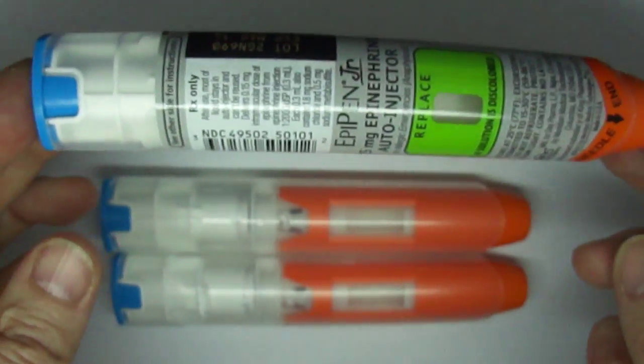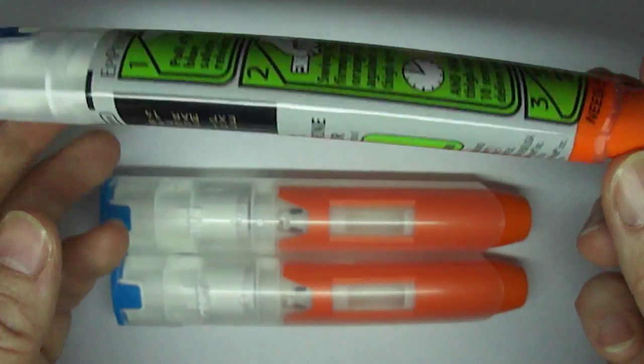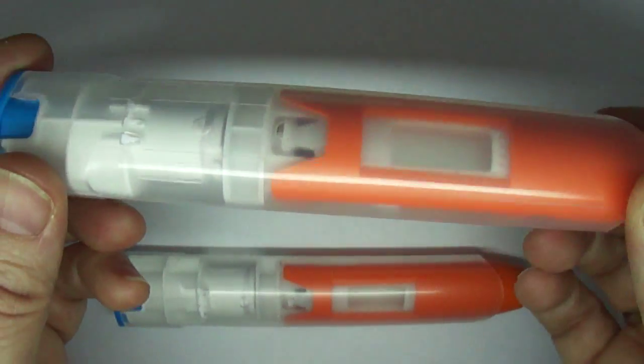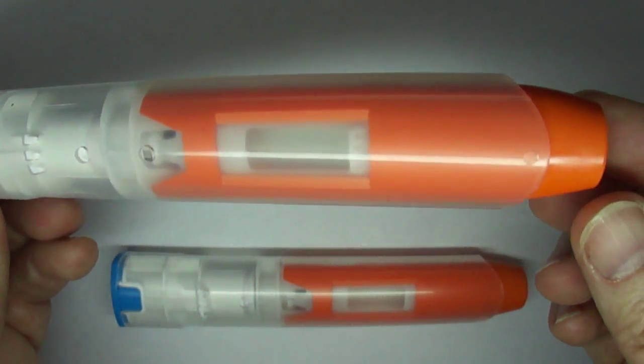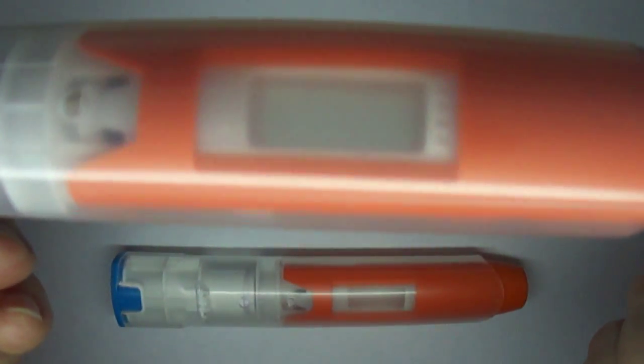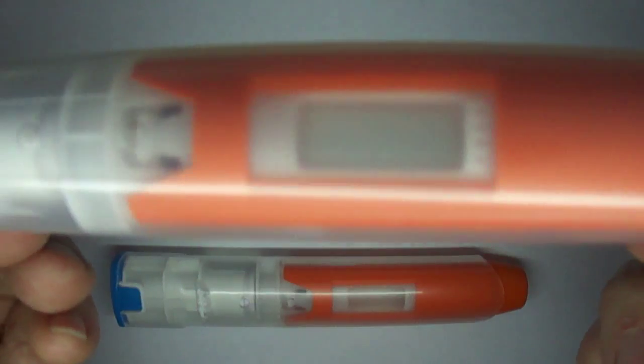So this is a normal EpiPen Jr. This device has had the plastic label removed. It is otherwise a normal, unfired EpiPen Jr. And you can see now a larger clear plastic window and again it has a slightly cloudy but not discolored appearance.